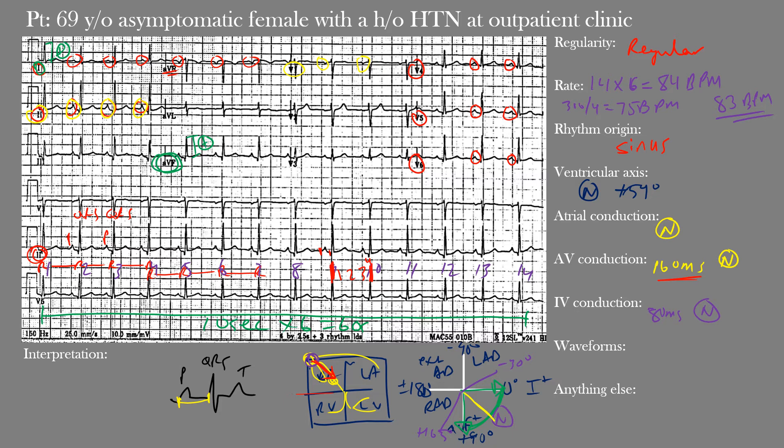Regarding the waveforms: the P waves are normal with no significant prolongation or increase in amplitude in leads II or V1. There are no abnormal Q waves. The T waves are present, asymmetric, and appear normal — T-wave amplitude generally decreases with age and tends to be lower in females. The PR segment is not significantly depressed or elevated. The QRS amplitude appears normal. The ST segment does not appear significantly elevated or depressed anywhere on the EKG. The QT interval is within normal limits — overall, no major waveform abnormalities.